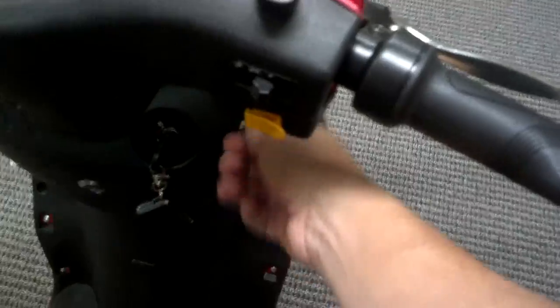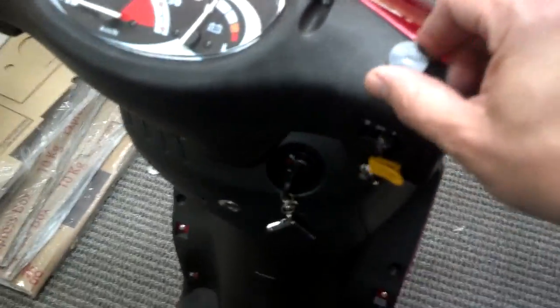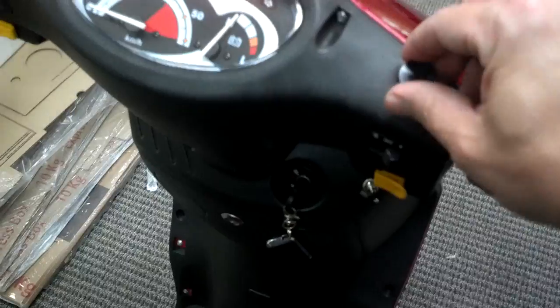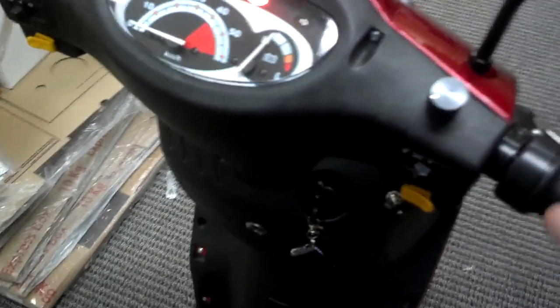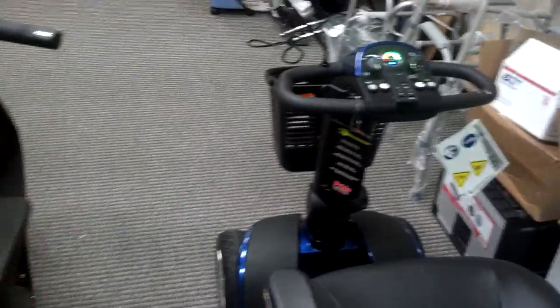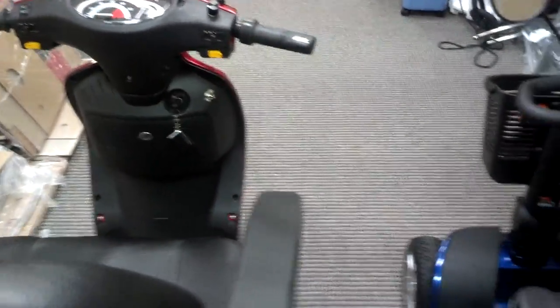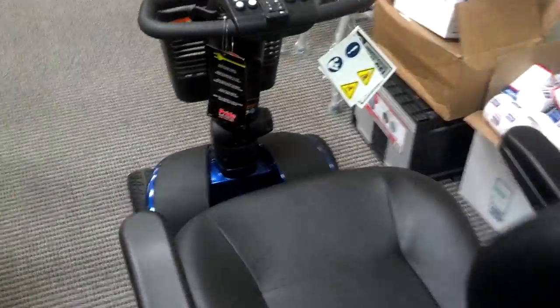This is the forward and backward switch — all you do is switch up for forward. And this is the dial-down. This will not dial down the acceleration; all it will do is dial down how fast it will go. This scooter goes double what the Pride one does — that's very important. So when you're trying to choose a scooter and you're worried about how fast you're going, obviously getting there twice as fast is sometimes important to people.